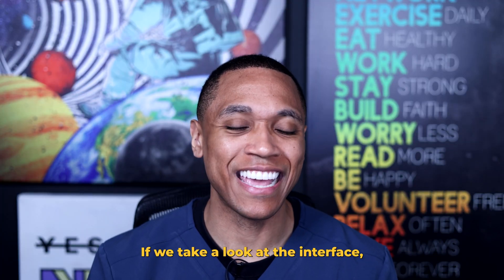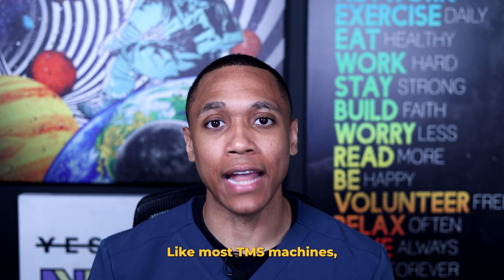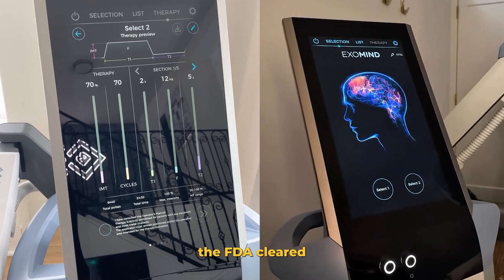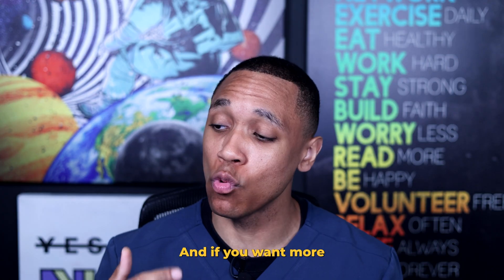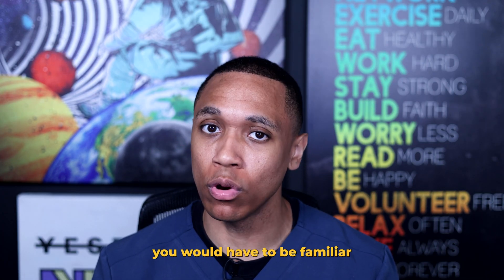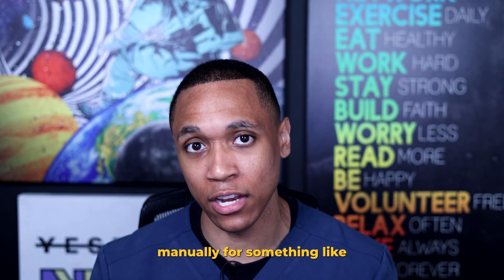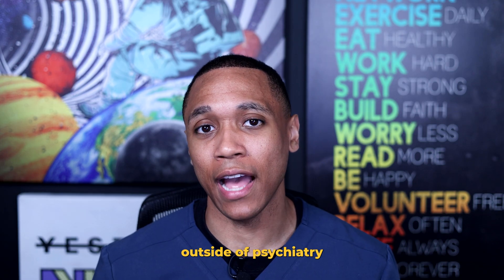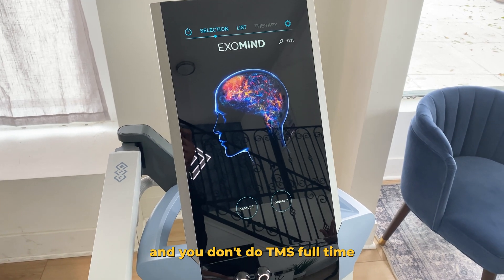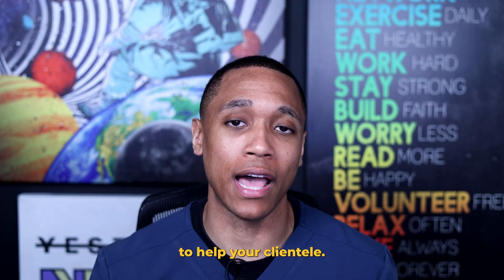If we take a look at the interface, it does look pretty simple, user-friendly, and customizable. Like most TMS machines, the FDA cleared and signature protocols will be preloaded onto the machine. And if you want more advanced protocols, you would have to be familiar with those protocols to make the necessary adjustments manually for something like iTBS, continuous TBS, or repetitive TMS. If you are a specialty outside of psychiatry and you don't do TMS full-time, using the standard FDA clearances is more than enough to help your clientele.